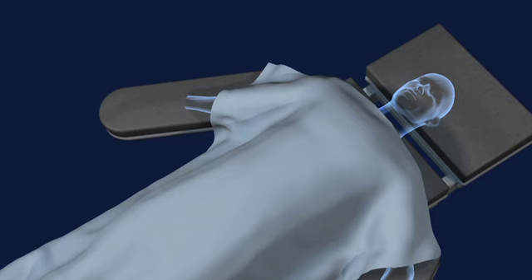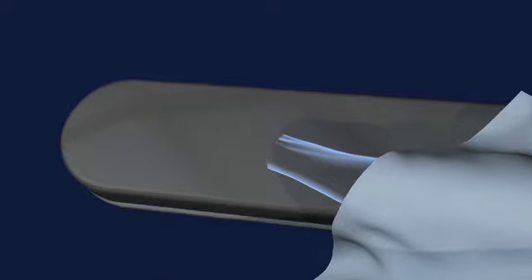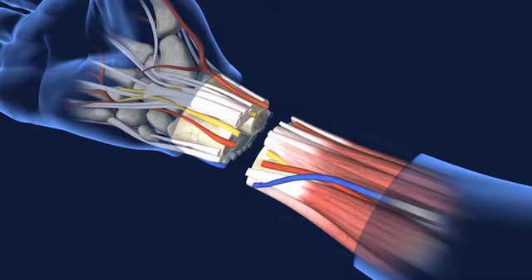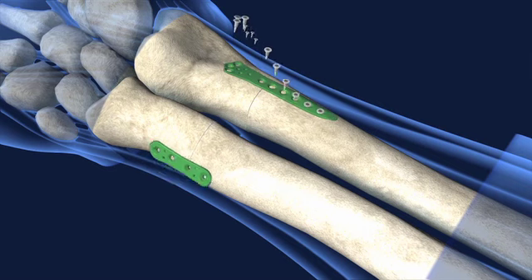The hand transplant procedure begins as incisions on the recipient arm and donor hand reveal the deeper structures. The donor hand is attached by first connecting the radius and ulna bones with metal plates.